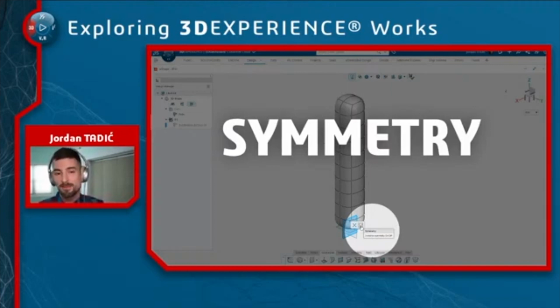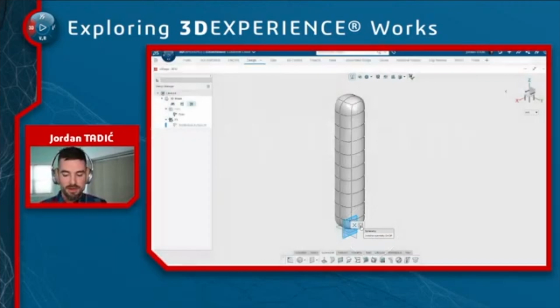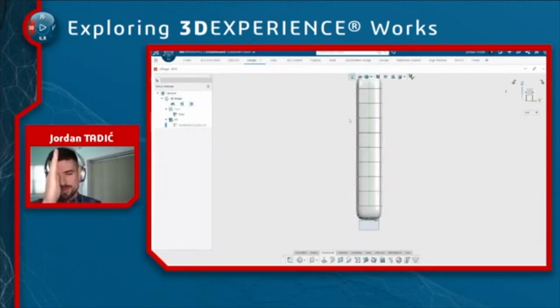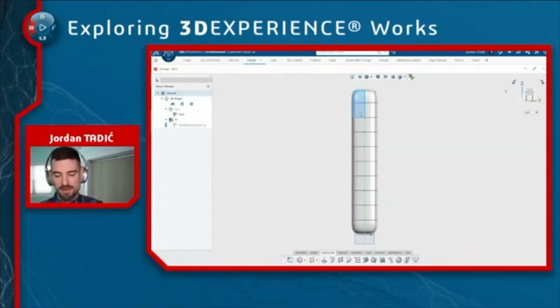And here, if we select on a plane, it says, hey, do you want to make it symmetrical about that plane? And I do. So it will automatically choose that plane and start up the symmetry command, which is that green line going right down the center of our model.